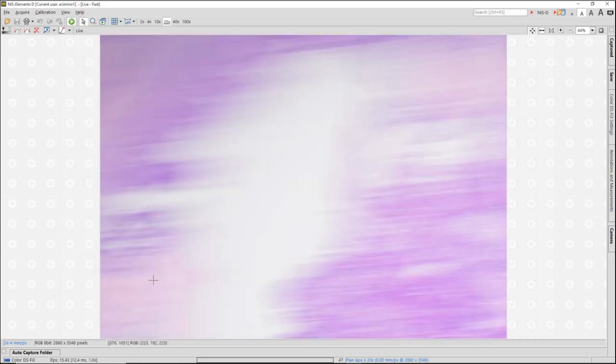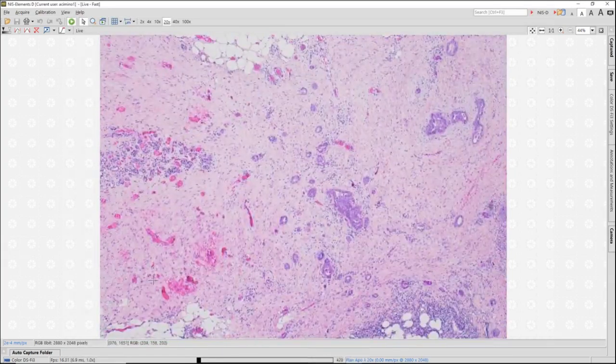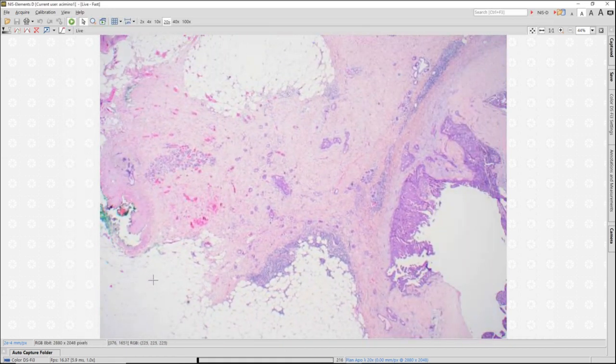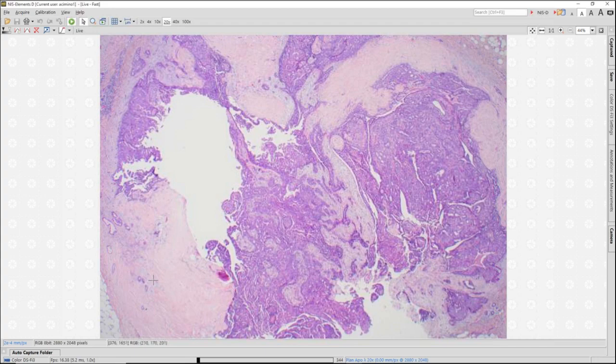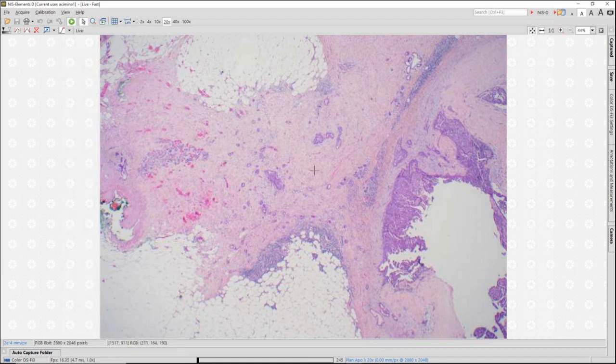The feature I want to point out, in addition to the diagnosis, is that intraductal papillomas frequently show needle tract displacement on excision if they've been core needle biopsied before. And here in this field, we see the intraductal papilloma. And as we come out to this side here, I can use my arrow, that's easier to see, we see an almost linear row of these small tubules that are almost, you can imagine, literally pulled out through this stroma in a linear row.